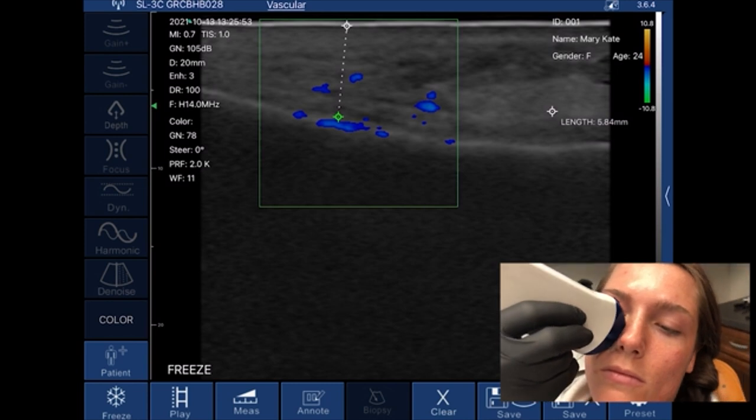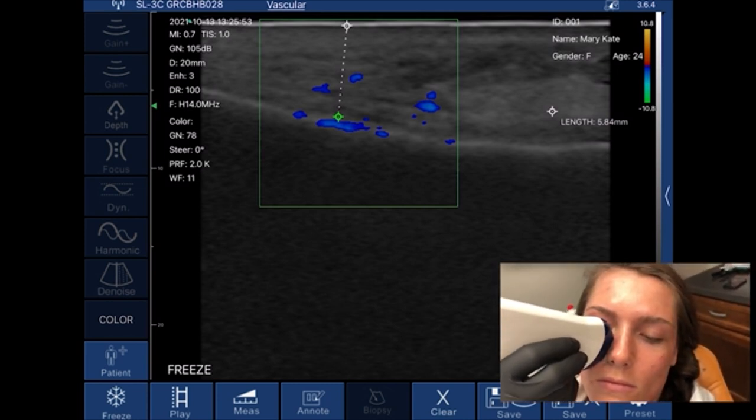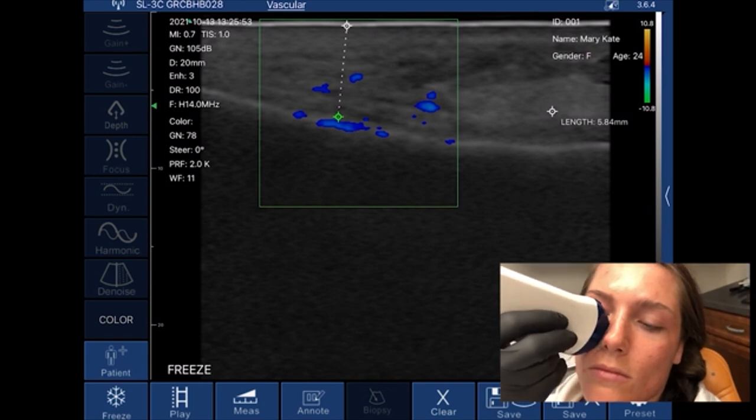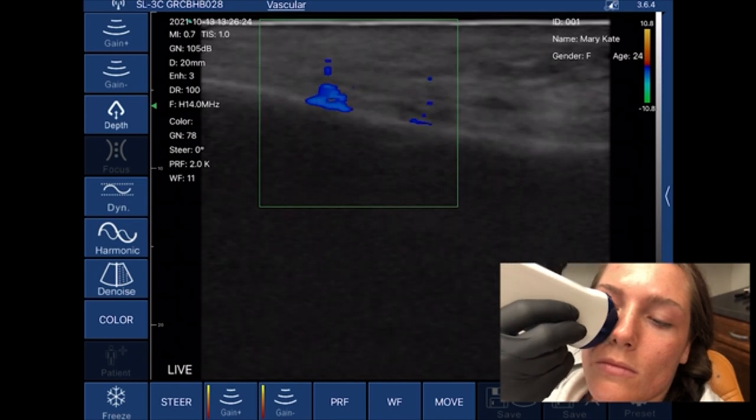Simple anatomy mapping. How long does this take? A minute or two. Now I know exactly what I'm dealing with here, and that really gives you so much potential for knowing the anatomy, for safety, and everything else.